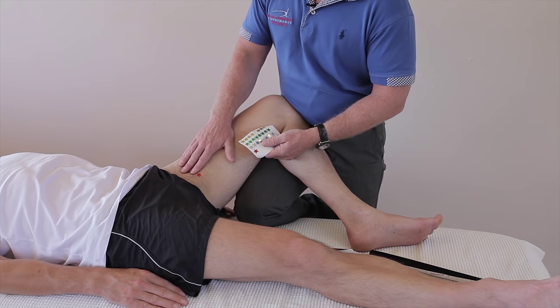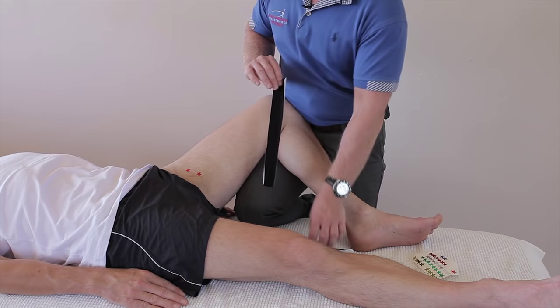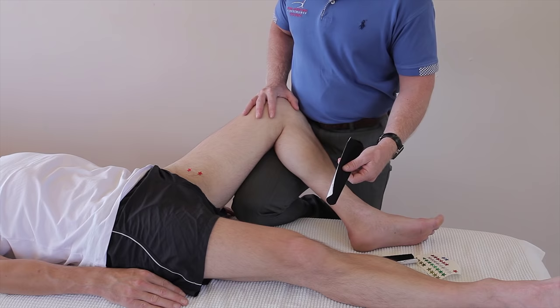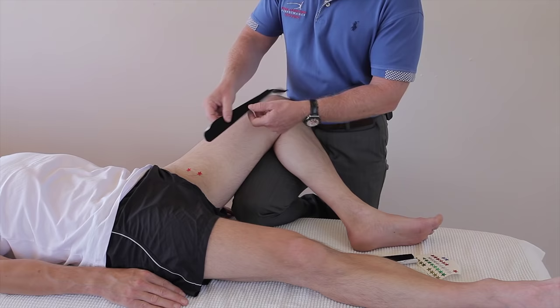What I've done is prepared two I-strips, so we're going to offload this area. For the first one I'm going to peel back this area, and with the leg being in this position on stretch — this is a position I tend to use to encourage the lengthening of the adductors.